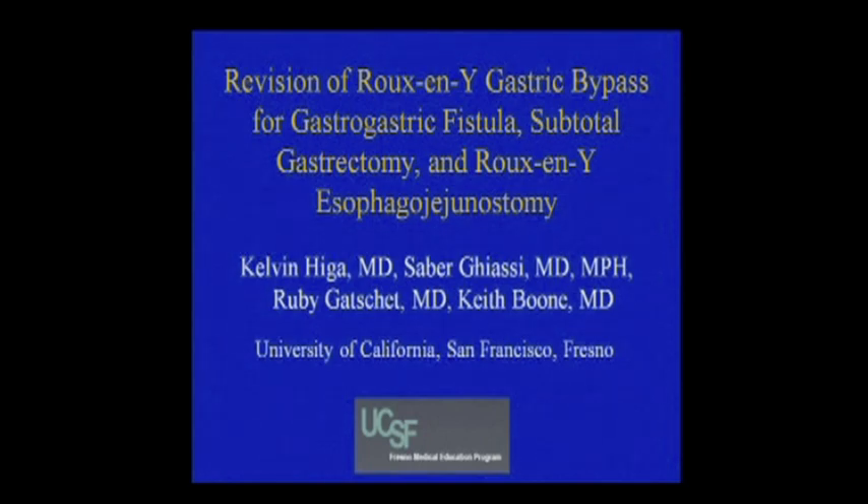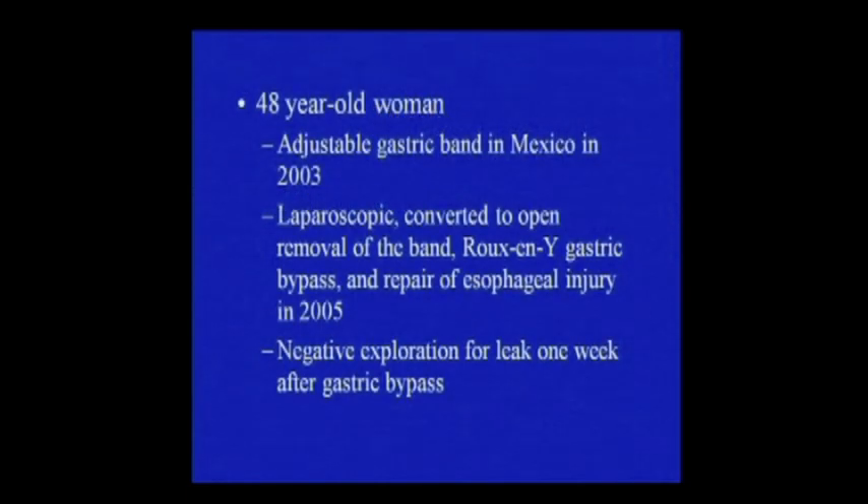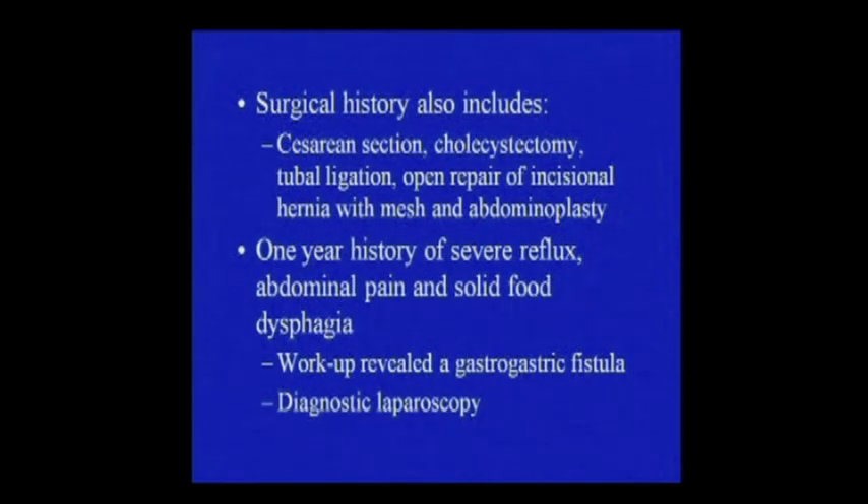This video is of a challenging case of gastro-gastric fistula after Roux-en-Y gastric bypass. The patient is a 48-year-old woman who had an adjustable gastric band placed in Mexico, followed by a laparoscopic converted to open revision to Roux-en-Y gastric bypass at an outside institution in the U.S. She presented to us with a one-year history of epigastric pain, solid food dysphagia, and severe reflux, and on her preoperative workup she was found to have a gastro-gastric fistula. She also had an extensive past surgical history, which included open hernia repair with mesh.